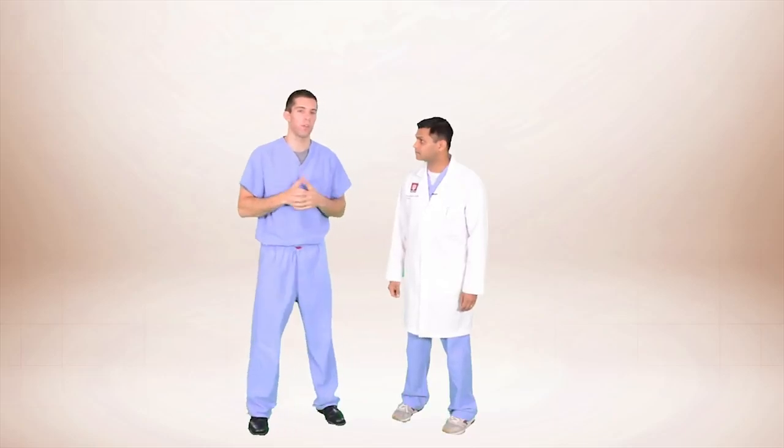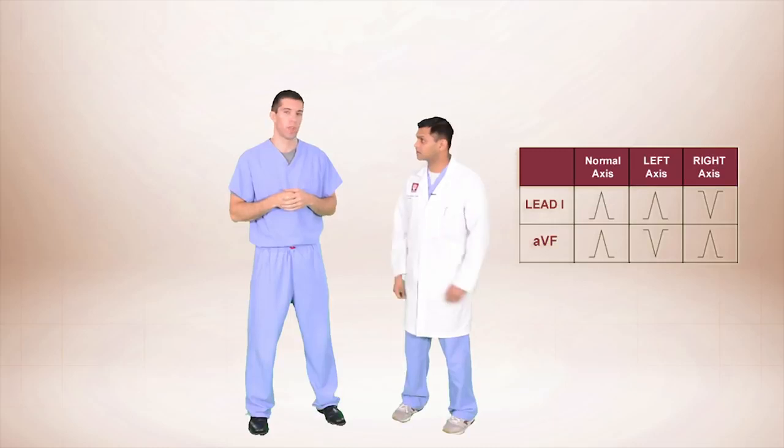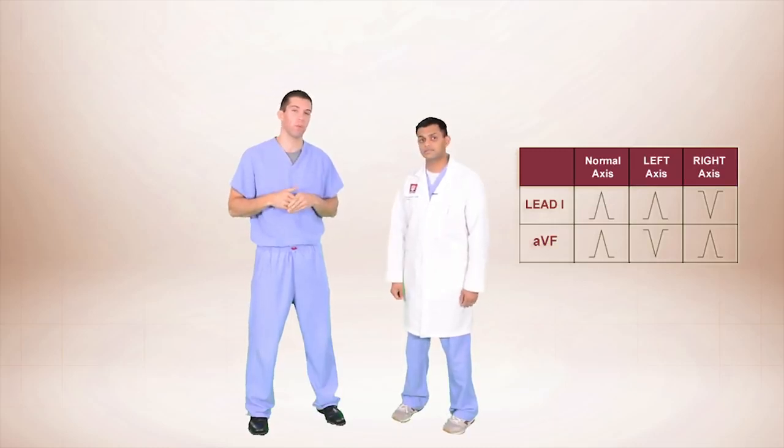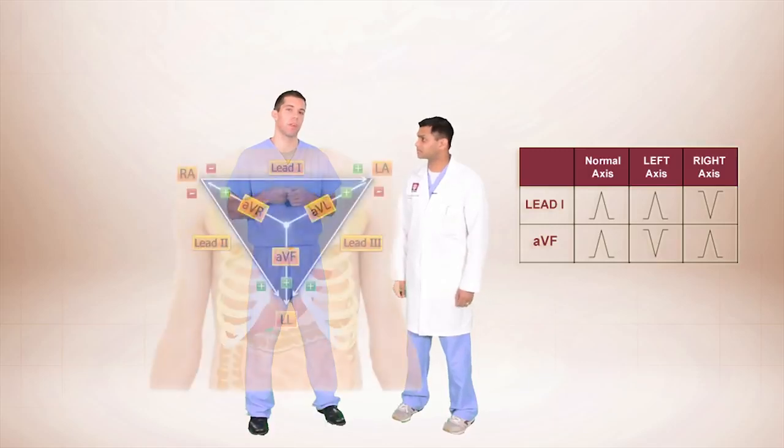Yeah, so I really like to use the quadrant method. I've heard about that. I like it. Yeah, so the quadrant method, we mainly look at the QRS complex in 2 leads. Leads 1 and AVF. But what about all the other leads, Mark? Well, they're important too, but we like to keep it simple. Simple is always positive. So remember that lead 1 runs horizontally and to the patient's left, and lead AVF runs vertically and towards the patient's feet.